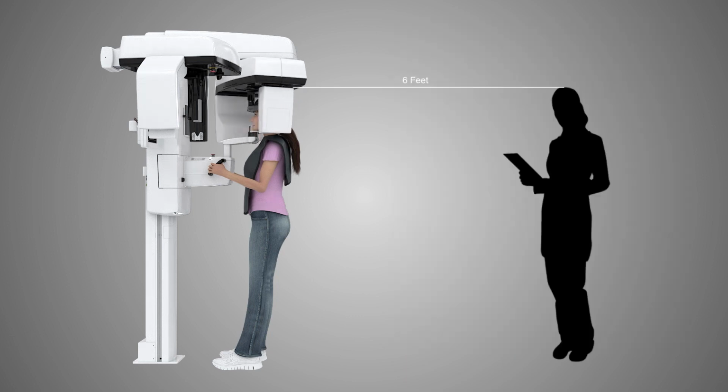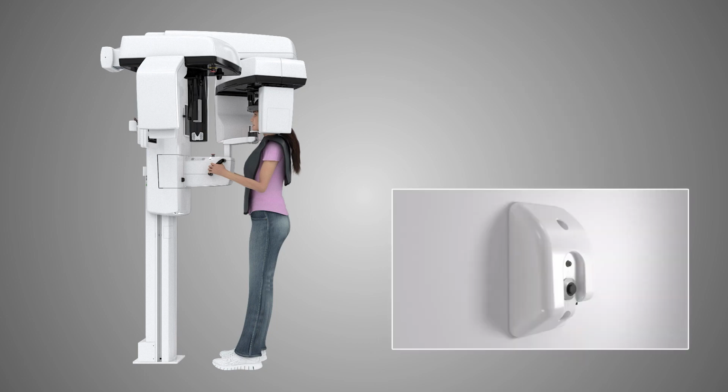Move a safe distance away, at least 6 feet, or behind a suitable X-ray shield while maintaining line of sight to the patient during exposure. Press and hold down the exposure button. The rotating unit rotates around the patient's head. An audible signal will sound and the exposure warning symbol on the touchscreen will appear. Once the image has been acquired, the rotating unit and the audible signal stop.